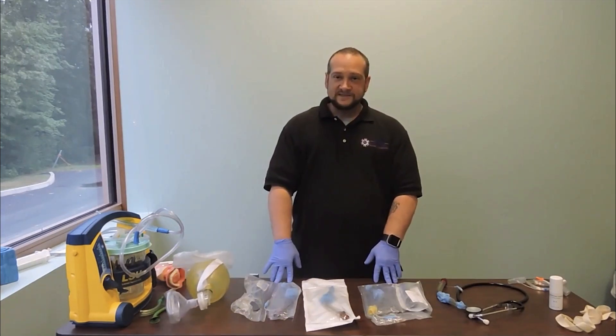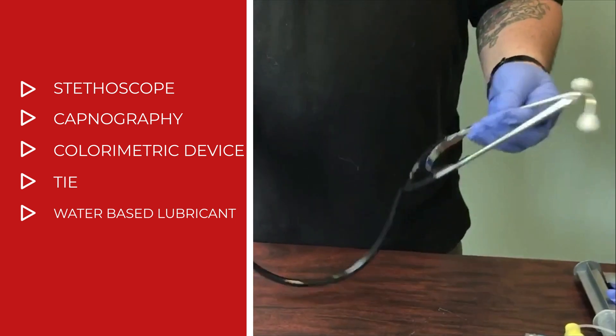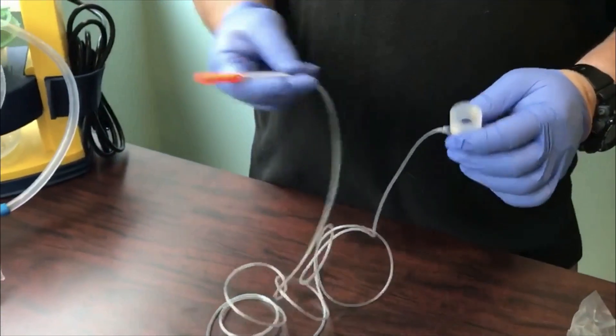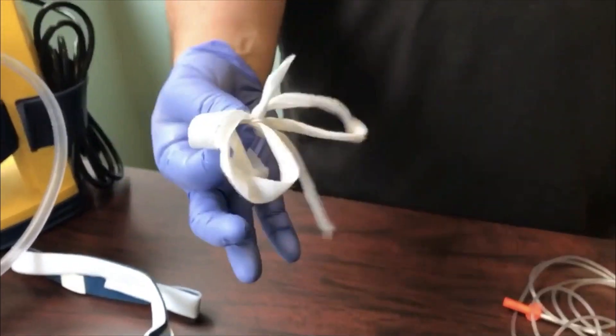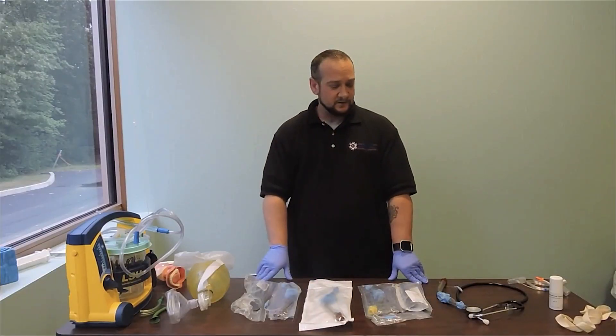We want to make sure we have the correct size King Airway, our stethoscope to confirm placement, our end-tidal capnography to look at waveform, and our colorimetric device. We also need our securing tie, and anytime we're using these devices, we want to make sure we have water-based lubricant to ensure smooth application.